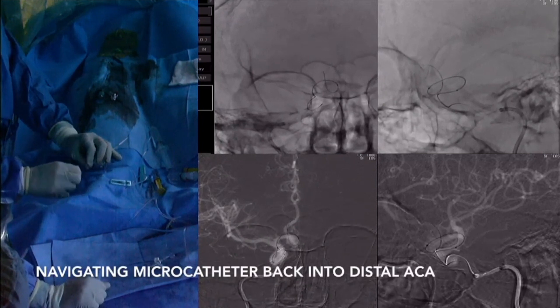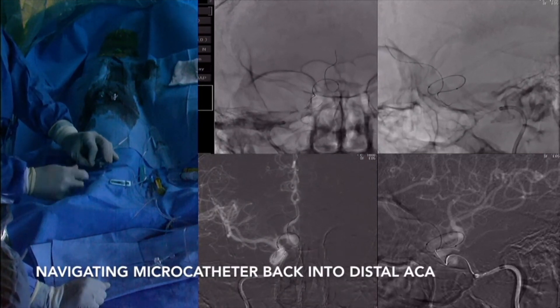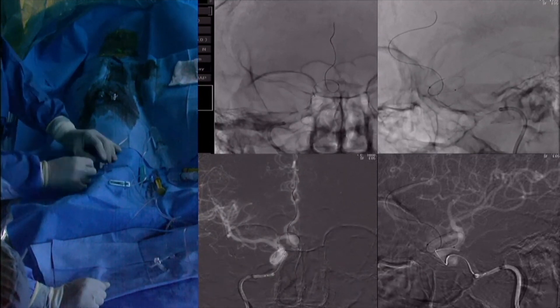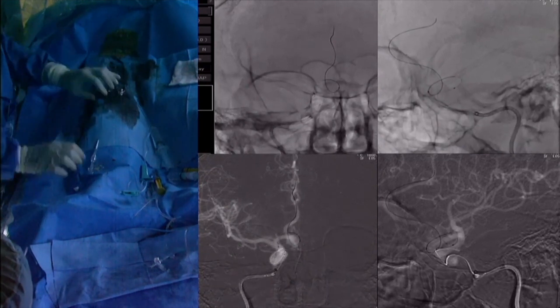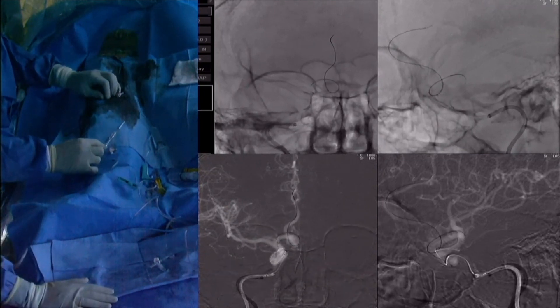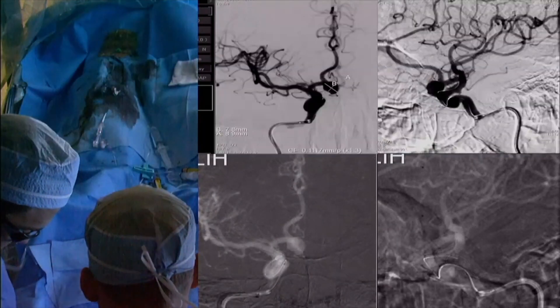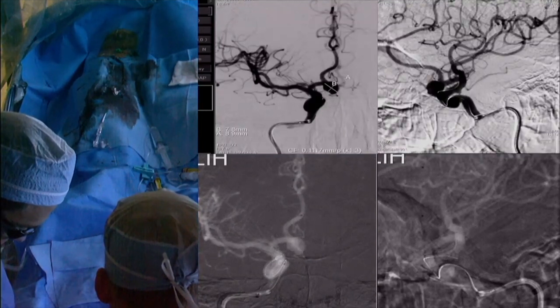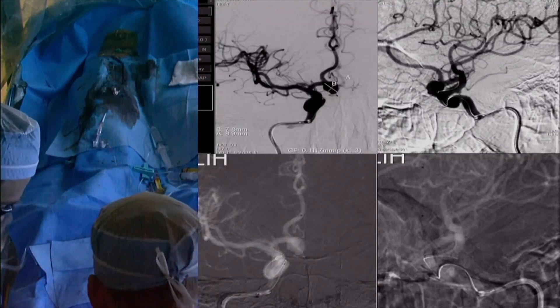At this point, we realized we would not be able to reduce the loop of the microcatheter, so we navigated the wire distal and brought the microcatheter once again around the aneurysm into the distal segment of the A2 portion of the anterior cerebral artery, as shown here. Here we are measuring the parent vessel size at approximately three millimeters in order to size the stent.